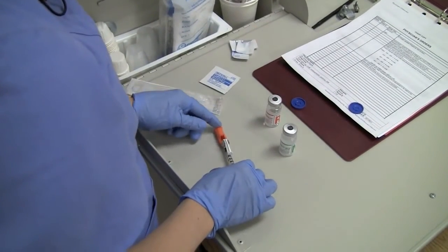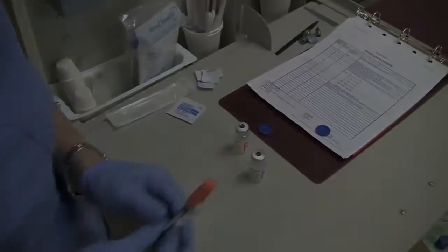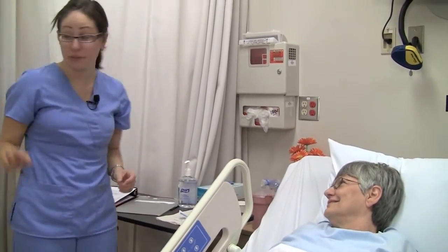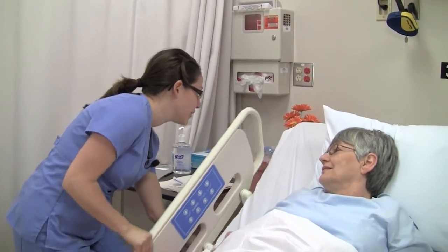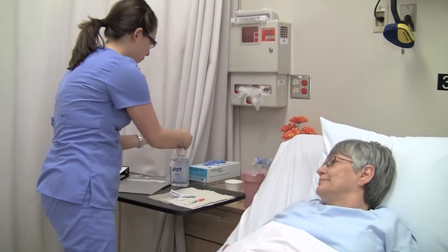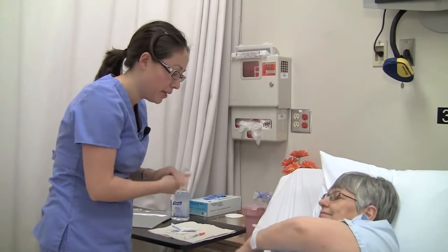Withdraw the needle and replace the cap using the scoop method to maintain sterility. Recheck the patient's ID and create privacy. Please tell me your full name and date of birth. Alma Jones, 2638. Thank you. I'm just going to lower this side rail here. Wash your hands. I'm going to need access to your arm — I'd like you to raise your arm up.